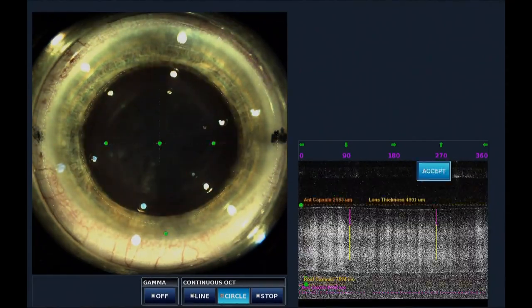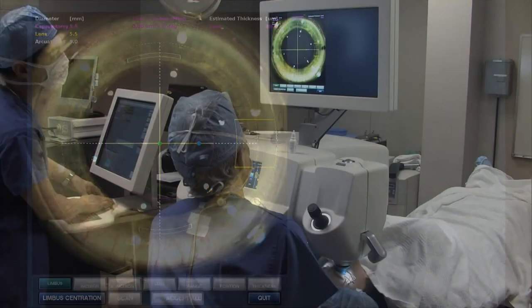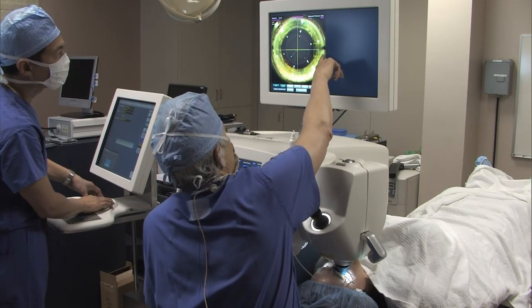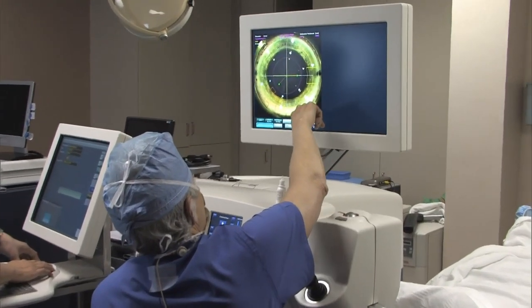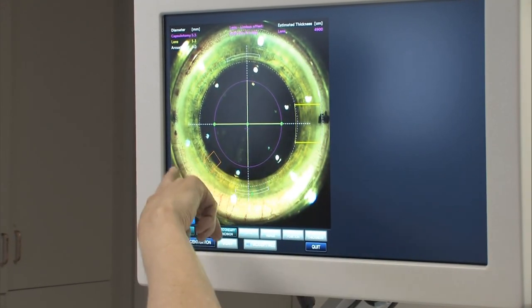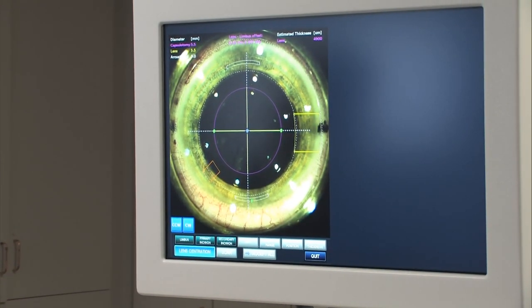Now we're after a pretty good centration, and Melvin — Dr. Sarabaya — is going to set our incisions. It's really kind of drag and drop. We want this incision pretty much at the arcades, and I think we've got that. We have our arcuate incisions nicely placed. We'll move those up just a bit, and we'll have our secondary incision back a little bit farther, towards the limbus.